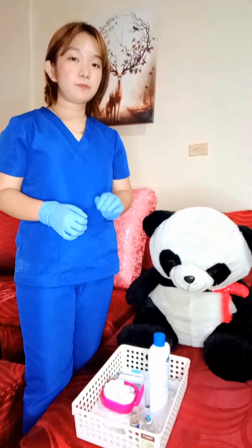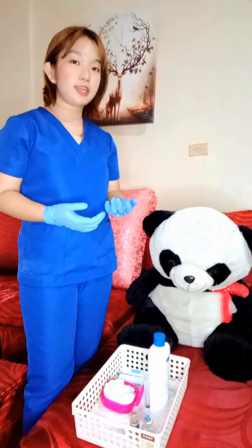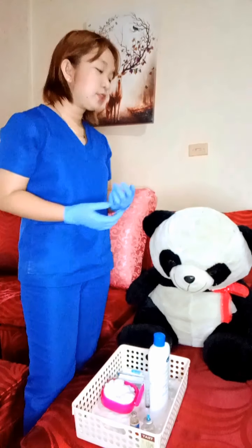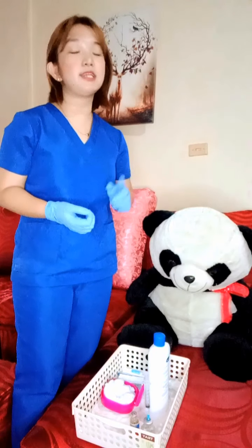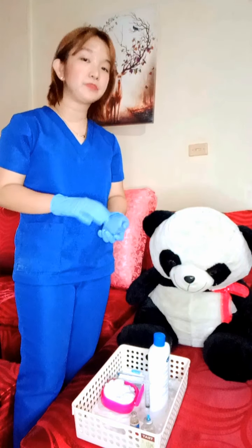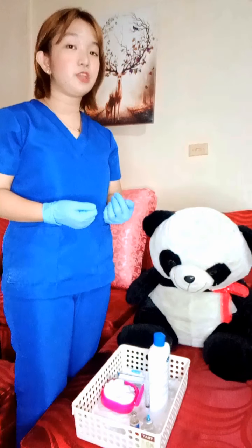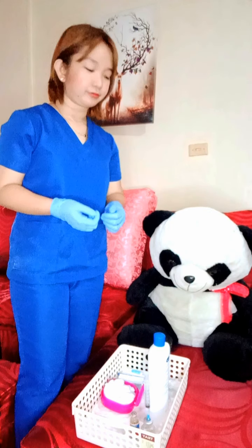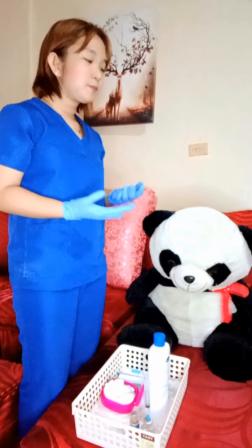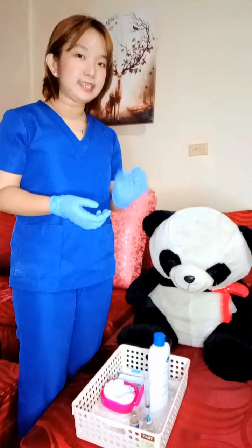The next step of the procedure is to explain to the patient or client the purpose of the medication and how it will help them. Talk to the patient, and it is important to use language that can be easily understood by the patient. Also, in explaining, we must include some relevant information about the medication that we will administer. Once you finish explaining the purpose of the medication, we can now select, locate, and clean the site.